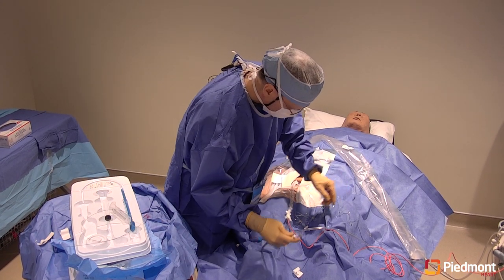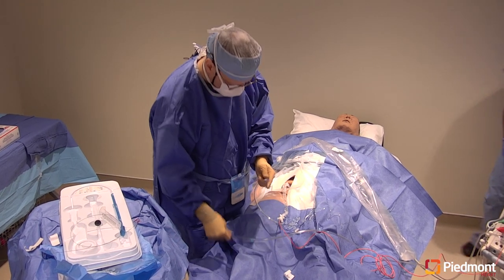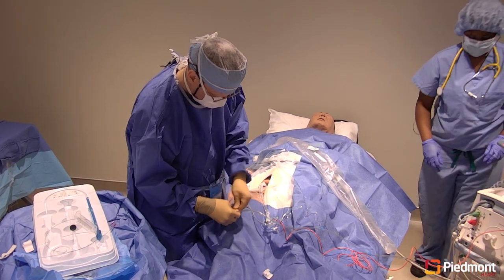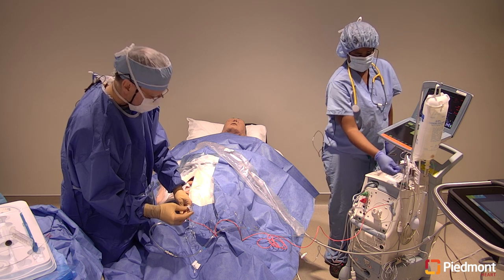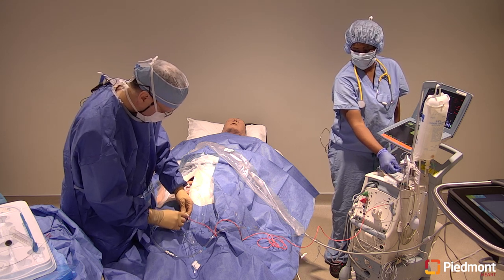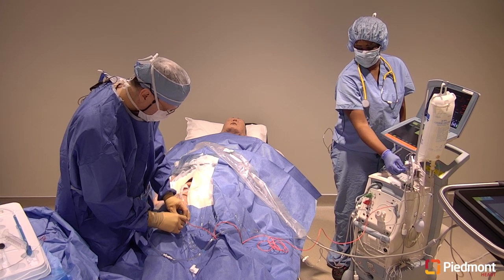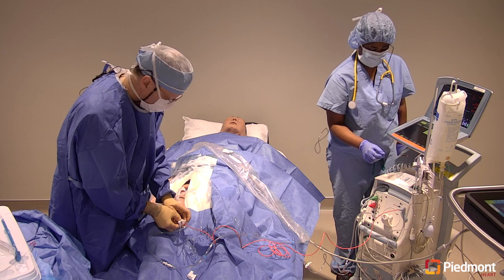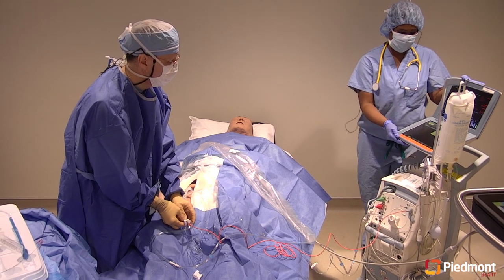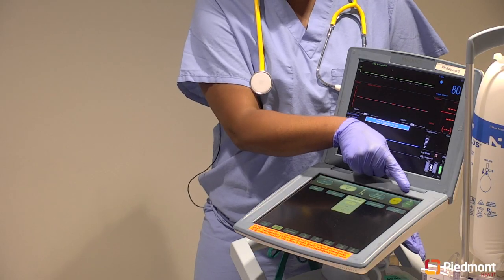Okay, and let's hook up your gas line. Can you flush your line, please? Flushing. Flush the pressure. And off. Line again. Perfect. Okay. All right, ready to start. Start.